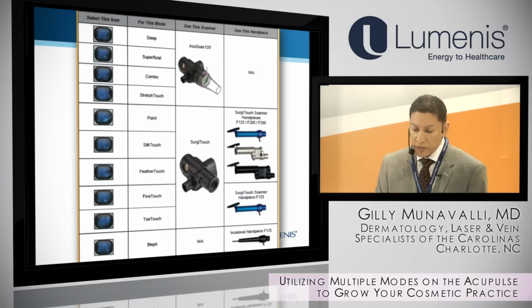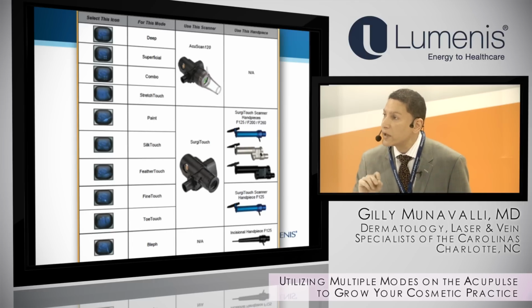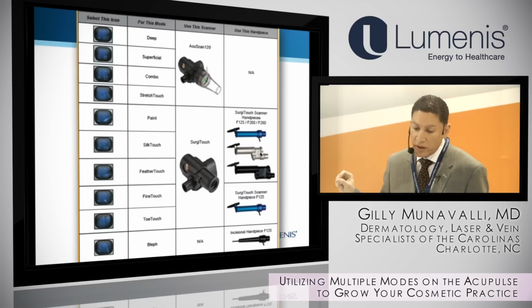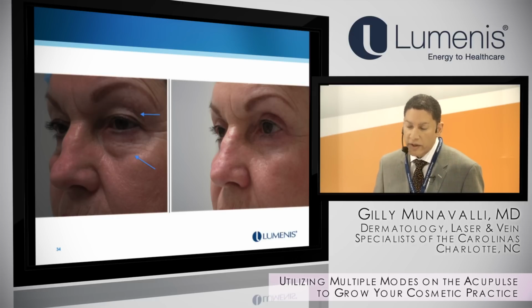So we're going to switch gears to the incisional handpiece. The incisional handpiece is used for cutting, obviously. Continuous wave cutting motion, typically 5 watts, 6 watts, somewhere in that range. And you can use it to do excisions for skin cancers. I typically use it for eyelid surgery. And so a case like this, where she has upper eyelid heaviness, lower lid festooning. The nice thing with this laser is I can use the cutting mode to get rid of the excess skin, then put on the AcuScan handpiece combo mode and treat the rest of her face.